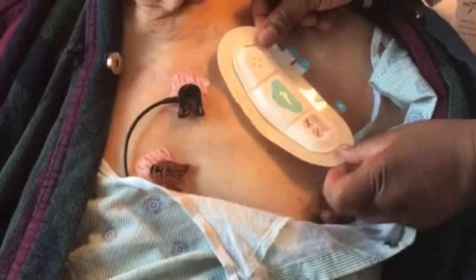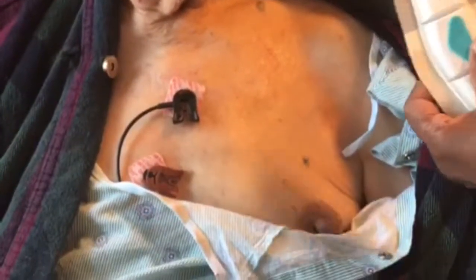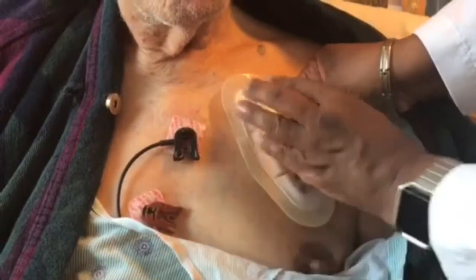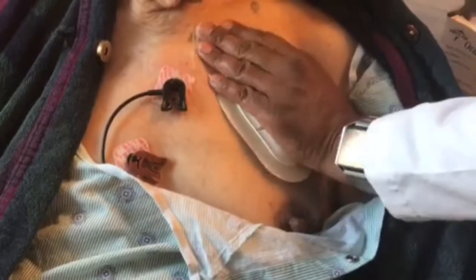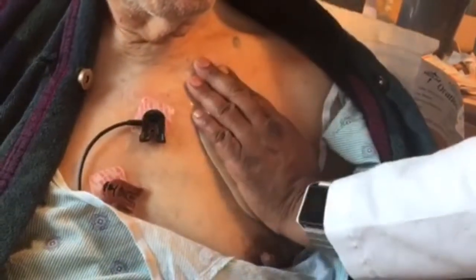Now I'm going to go back and make sure I line this up correctly. I'm going to take off label number two. In order to make sure this sticks correctly, you have to hold it in place and use your hand to warm it up for at least 30 seconds to one minute — it kind of melts and warms up the adhesive so that it stays in place. Hold that on for 30 seconds to a minute.